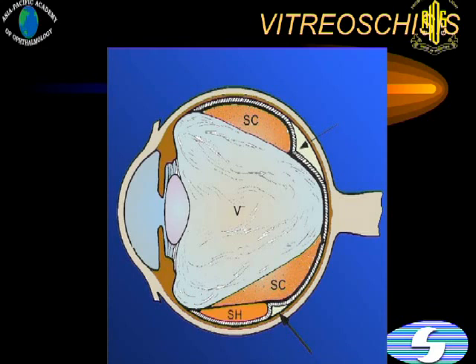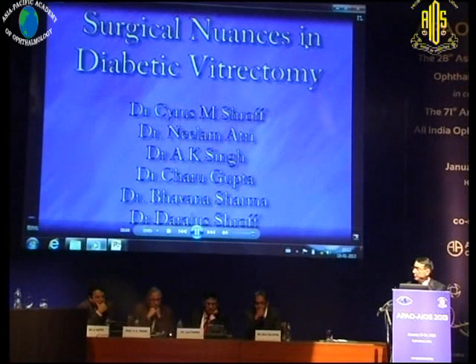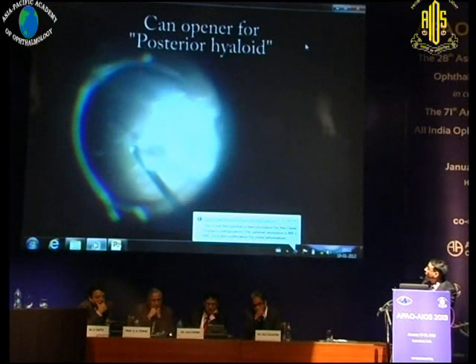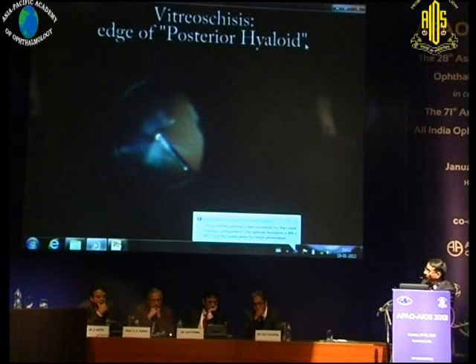In this video compilation we'll go through some of these concepts. This first case is not triamcinolone alone — this patient had asteroid hyalosis, which is guiding you to where the posterior vitreous detachment is. That can serve as a sort of spontaneous staining.